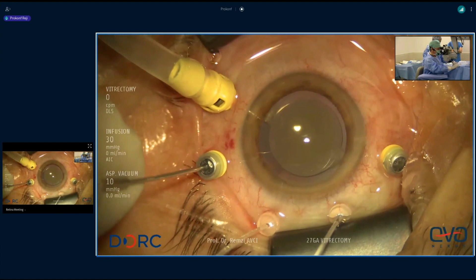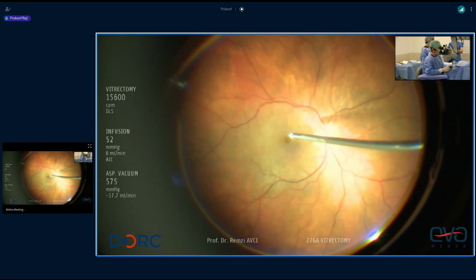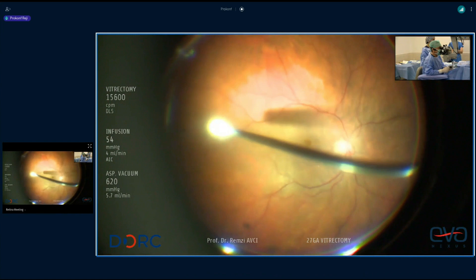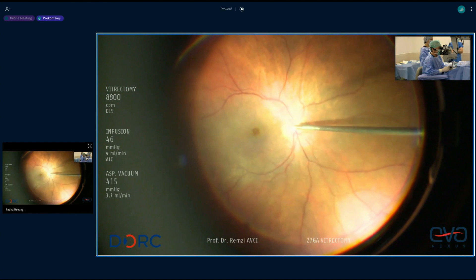I will apply a temporal inverted flap technique for this case, but there is some modification in my technique. We will first apply a vitrectomy and core vitrectomy and removal of the posterior hyaloid, then continue with the other steps. Have you already detached the posterior hyaloid? Not yet, Don. I think it was a partial detachment that was on the OCT.